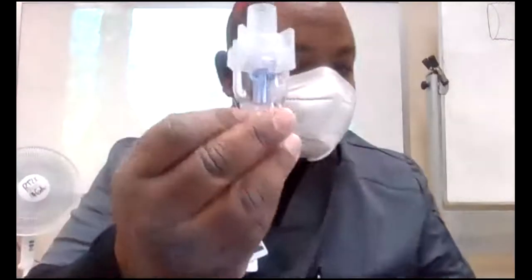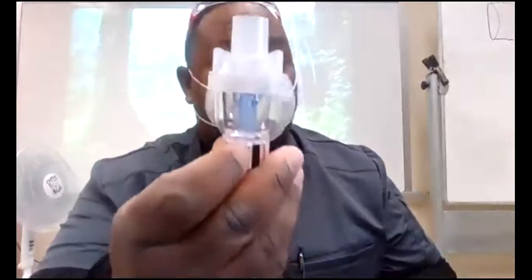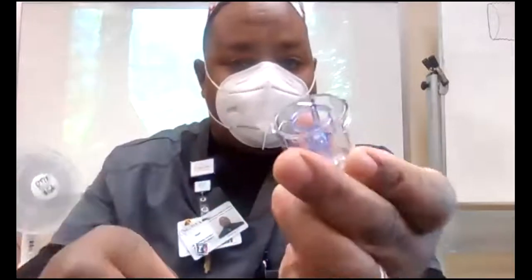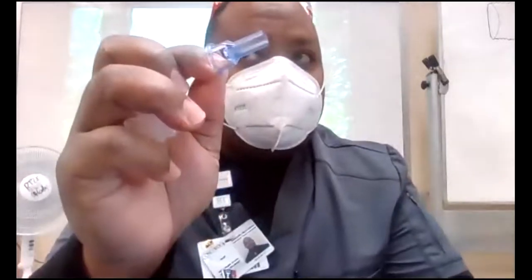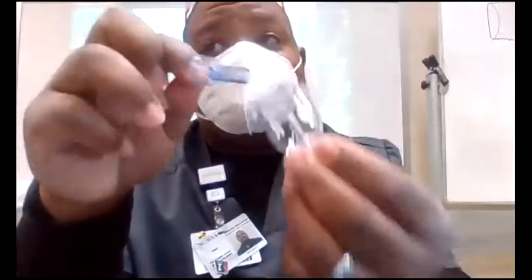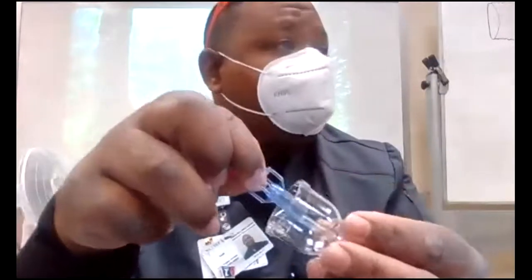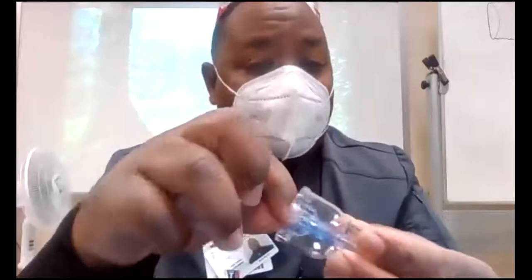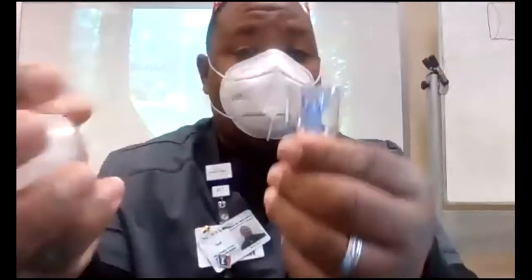I'm going to go over the parts of it so you know the parts. This is called the medicine cup. This is the medicine cup of the small volume nebulizer. You take the medicine cup off and you squirt your medicine down in there. Okay? This piece here, which is inside the medicine cup, what did I say this was? This is the baffle. Now, they're not always the same color or the same shape, but the device that's inside your medicine cup is the baffle, whether it's green, red, yellow, blue, circle, square, whatever it is. It makes the big particles into uniform, aerosolized smaller particles, okay? Without this baffle, it will not aerosolize, okay? So then I put my lid back on, okay?